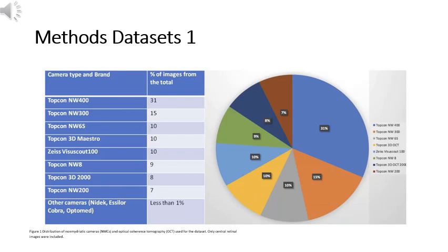Classification of image type, CFP, OCT, others, and eye of evaluation, right or left, was performed by one ophthalmologist. Labeling for quality assessment, presence of AMD, or glaucomatous optic neuropathy, GON, was performed by 2 independent retinal specialists. A third ophthalmologist assessed cases where there was no agreement, in order to establish at least 2 consistent gradings.